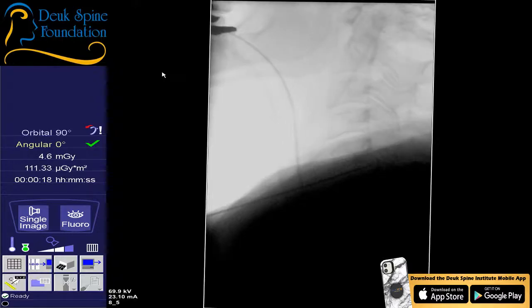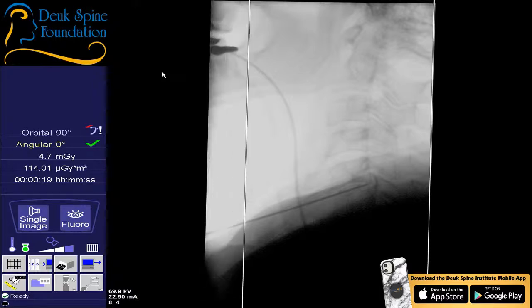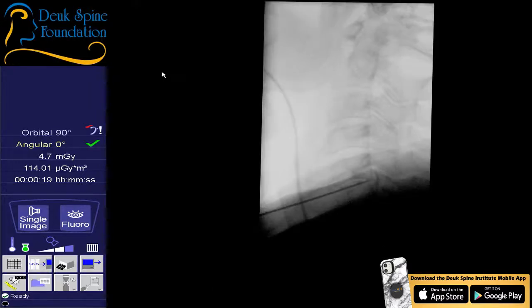All right, now I need a little pull. Just not too much, that's good. All right, perfect. So for those of you that can see the fluoro, you may want to cone it down a little bit so we don't have so much white and overexposure on the soft tissues up front. Keep the back, just move the front in. Good. And now let's see what we got there. That's better, much better. Look at that, beautiful. So you could actually see a tear in the back of the disc and the dye has leaked out. Look at that herniation back there.